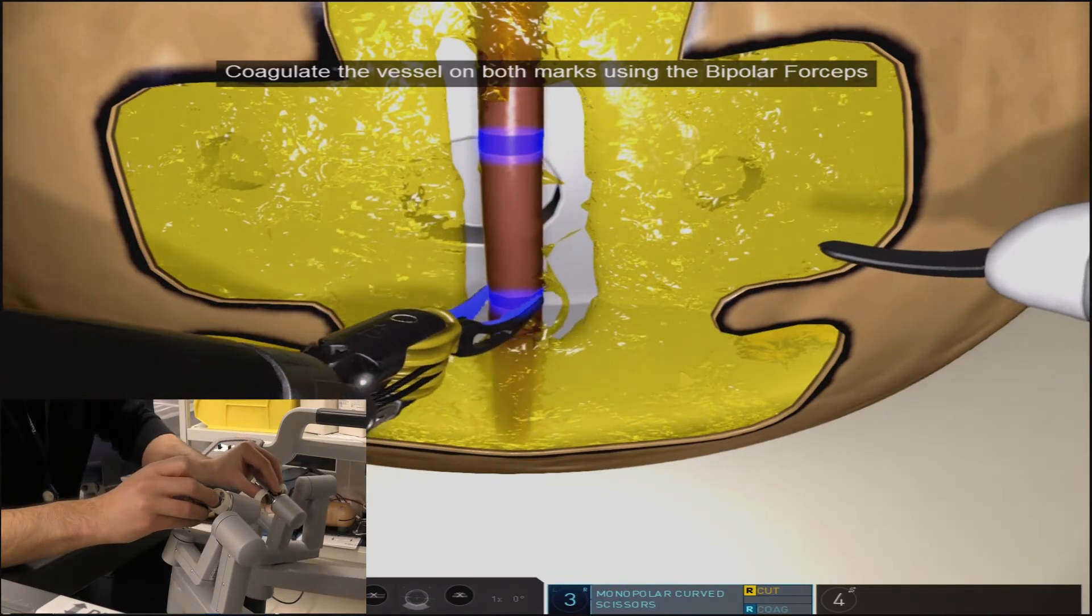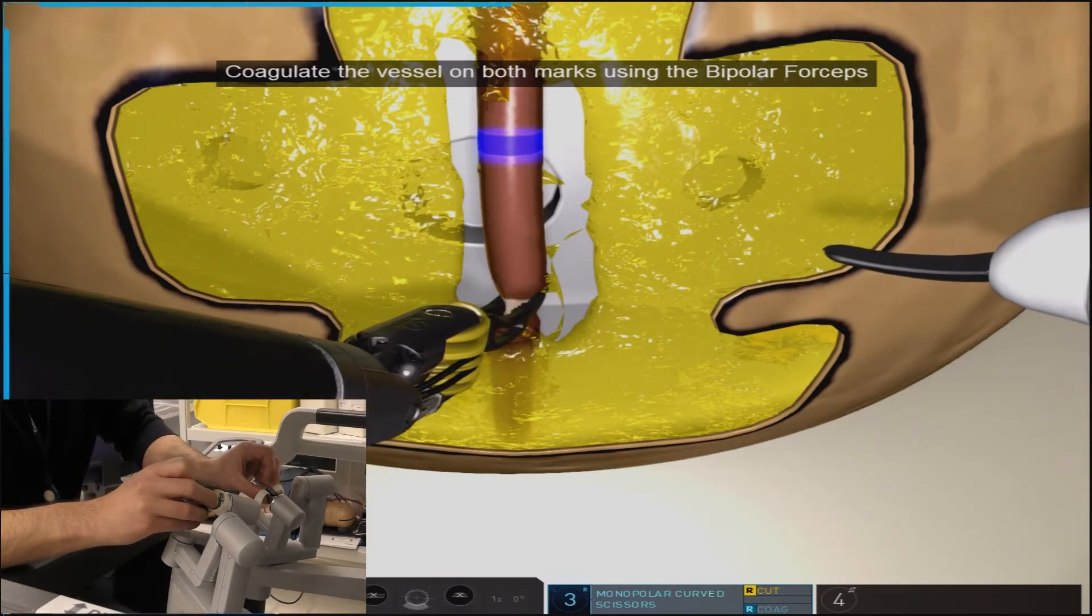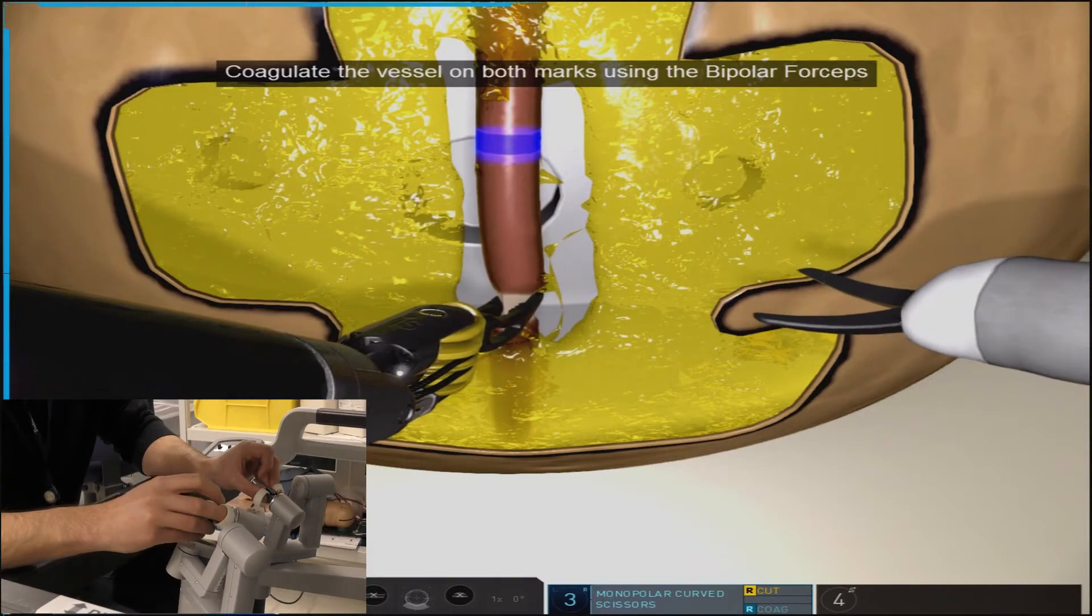And so now with the vessel well exposed, the exercise will prompt us to proceed with our bipolar coagulation.